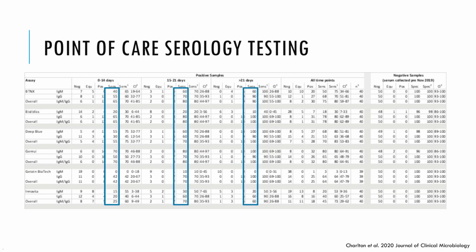So I guess there's a couple different options. One would be to allow point of care serology testing in those areas. And we were able to evaluate a number of different point of care assays when they first came out in early 2020. Just like the larger commercial assays, they were very poor at detecting antibodies before 3 weeks of infection. But post 3 weeks, they're actually pretty good. And if you combine their IgM and IgG scores, a lot of them had a sensitivity of 100% for the samples that we tested. So this would be a possibility. The challenge with these is then training people to do them, getting either a CLIA waiver to get into those areas, or extending your umbrella to more rural providers to do it. So it's a lot more challenging to get the point of care serology testing out.